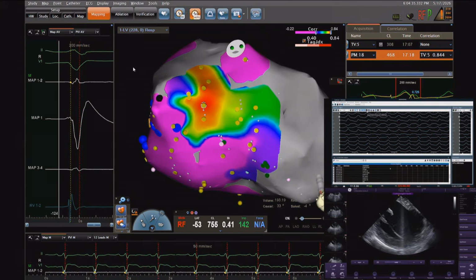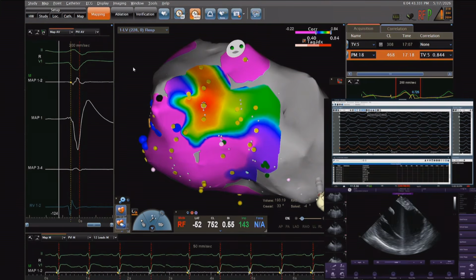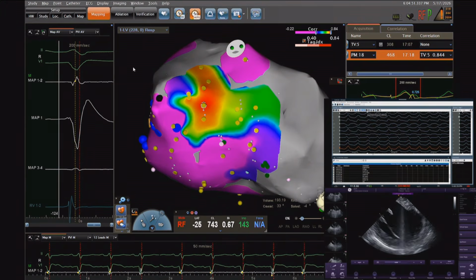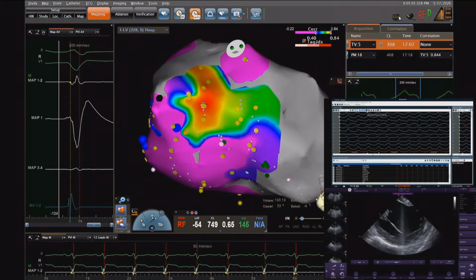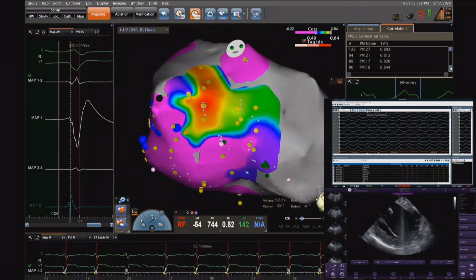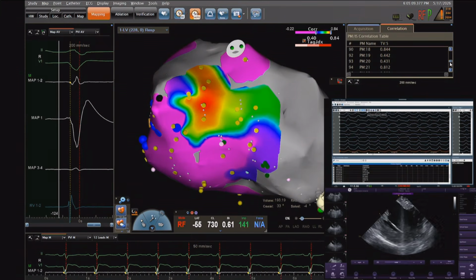Okay, so we did pace mapping for this rapid arrhythmia, which is from the basal septum, and these yellow points are points of pace mapping. And in color, we show the improving accuracy of matching with the template of the arrhythmia. And we reached, I think, 84, which is in this red area. So this is close to the exit. But we could not find... Now Christian has a microphone, so he can continue.